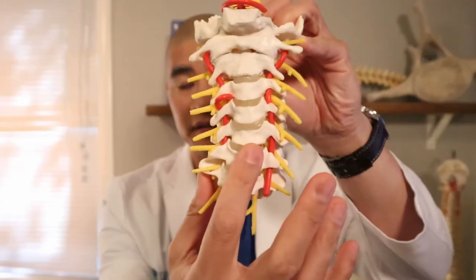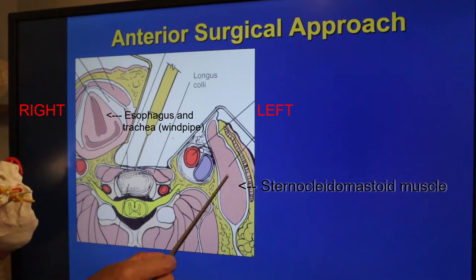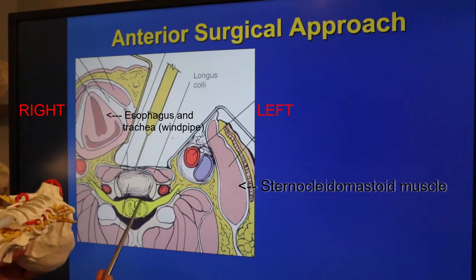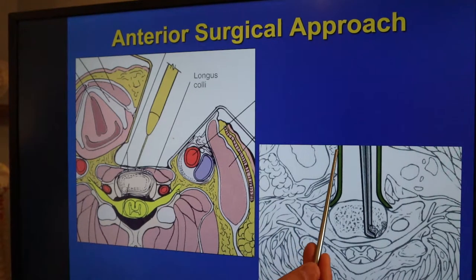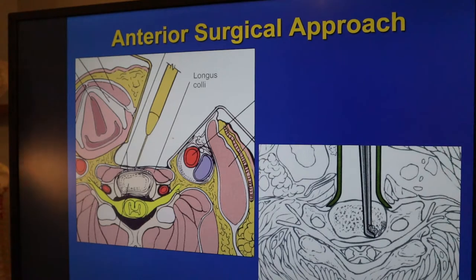After we make an incision in the front of the neck, we go down and find the front of the spine. This is the trachea and the esophagus, the sternocleidomastoid muscle, and the disc right here. We identify the front of the disc — there's the spinal cord, the nerves coming out, and the bone spurs. We put retractors in and then use small instruments, little burrs and curettes, to take the entire disc out, and then use instruments to take the pressure off of the nerve and spinal cord. These are very small one-to-two millimeter instruments done under microscopic magnification.